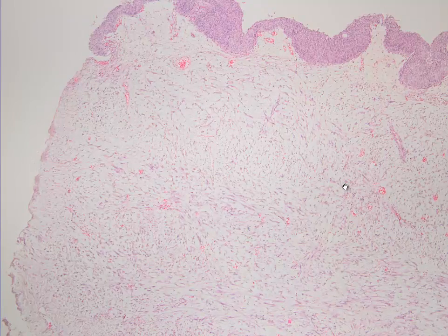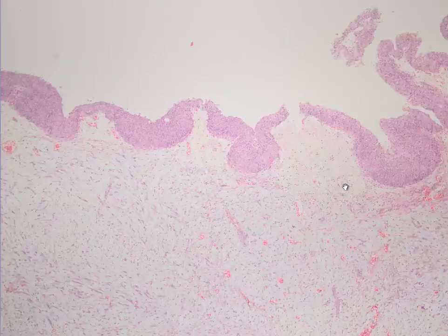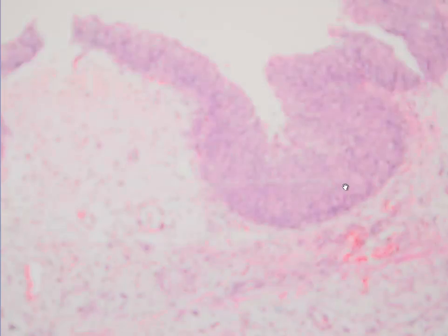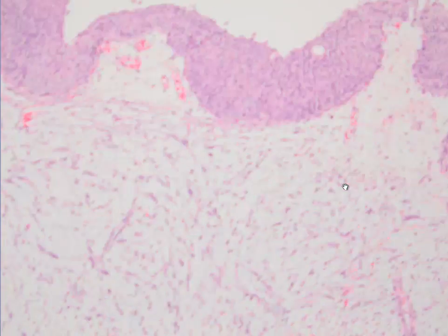So shall we finalize the case as sarcomatoid carcinoma? But here's a very important pitfall in bladder, and every pathologist should know. So the first thing that's against the sarcomatoid carcinoma, we don't have any dysplasia or urothelial carcinoma in situ or any papillary carcinomas in the surface.